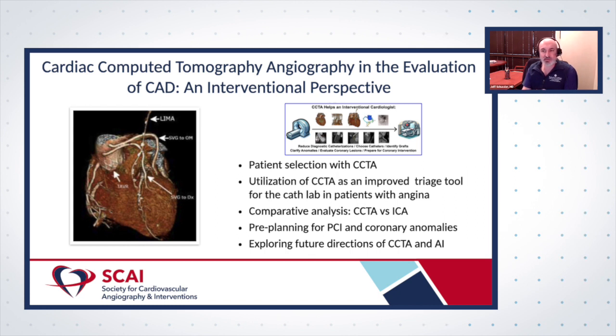What kind of guides you use? How long is your lesion? Whether this is going to be an easy or difficult intervention. And I think there's a lot of room for uplifting or uptraining some of the readers currently so that they can help us out when we're in the cath lab.